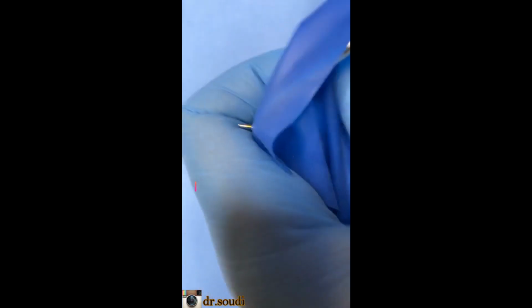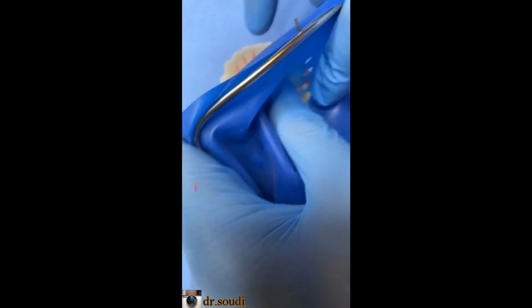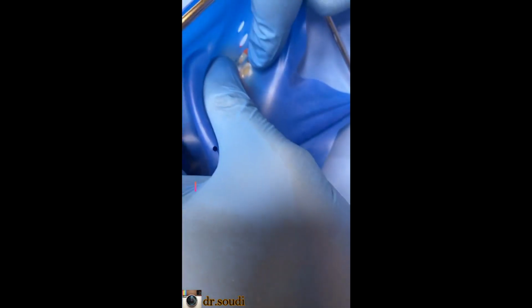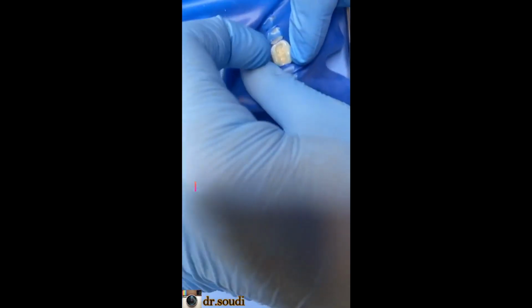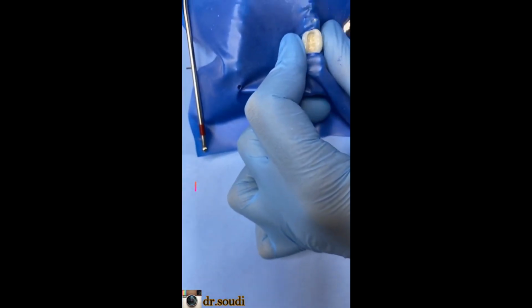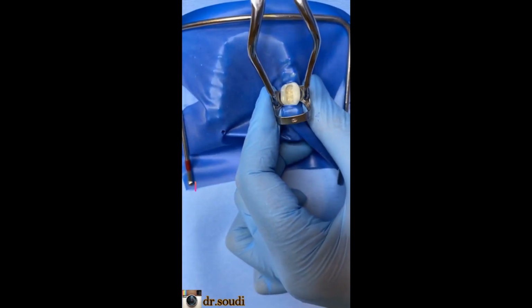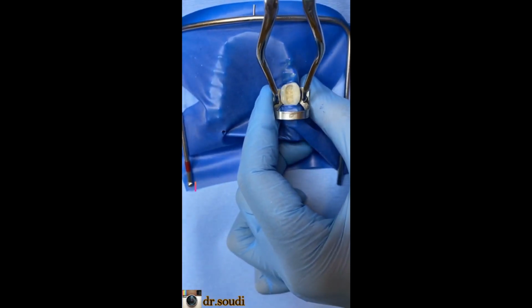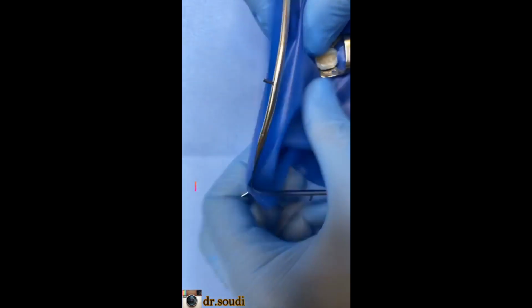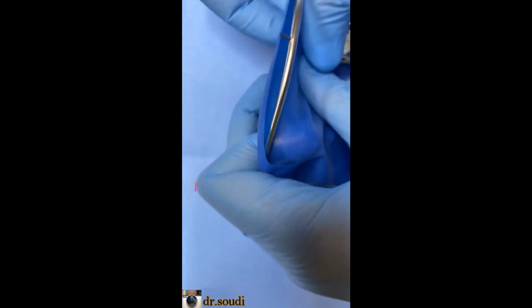So again, hope it will not cut now. Okay, I will place for this lower 6 first. We shall place the clamp first. The situation is more easy in the patient mouth because the patient mouth is not moving like this. Okay, like this.